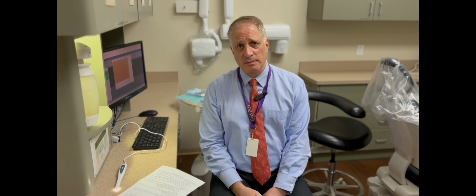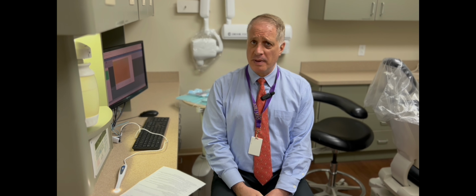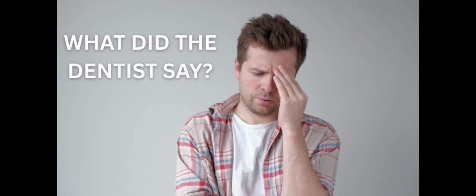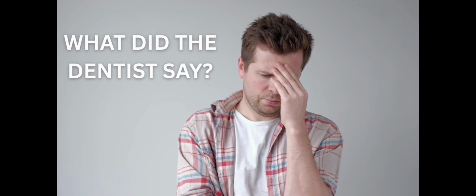Why do we want to capture oral images? I mentioned education. Education is critical for better patient outcomes. And we could use an oral image without using complicated dental terminology, which could often confuse the patient, embarrass the patient, and hinder them from asking appropriate questions. For example, a picture of swollen, inflamed, bleeding gums. That image says it all. There's no need for further explanation.